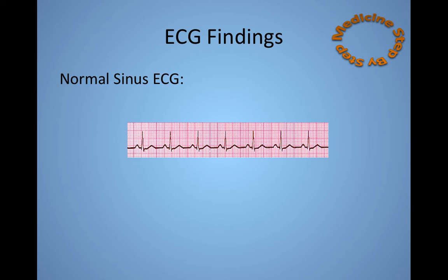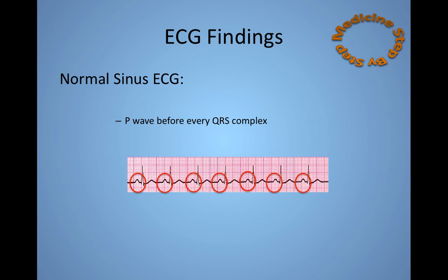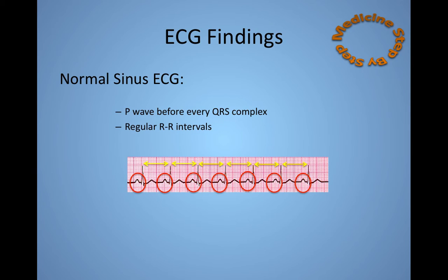Here you see the normal sinus ECG. There's a P-wave before every QRS complex, and the QRS complexes are regular, as seen by the regular R-R intervals, depicted by the yellow arrows.